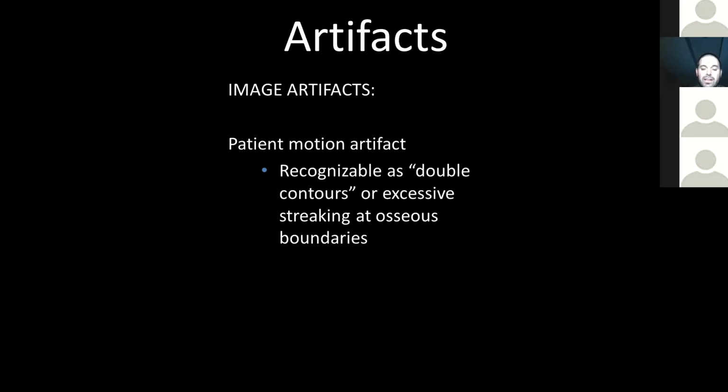If you put a patient in a cone beam CT machine and they move a lot, the scan is going to be a mess. You're going to know it. And most of the time, your staff will see them because they're monitoring that patient during the scan. They will see them move and most likely elect to retake that scan. What I'm talking about here is minor motion.